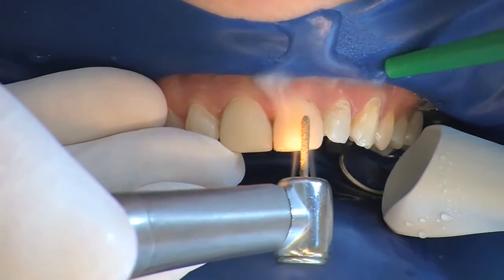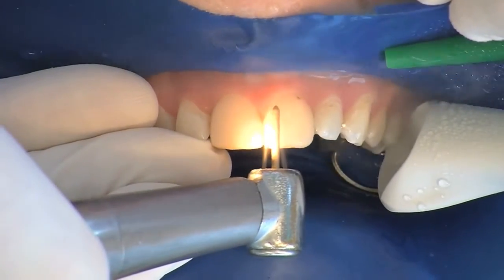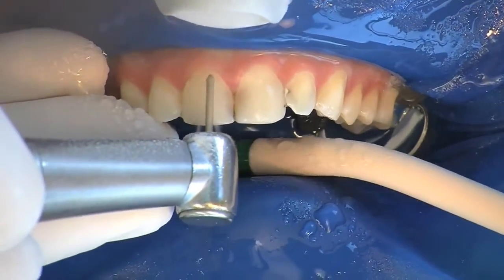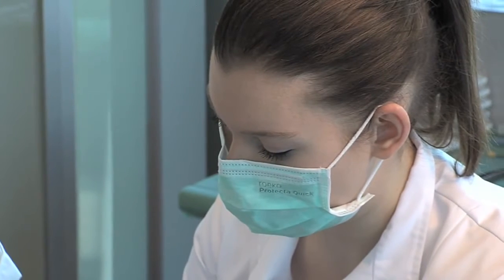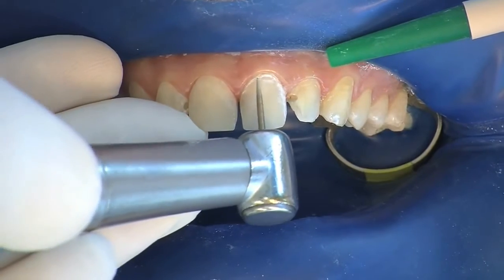This is followed, if necessary, by a reduction of the surface of the teeth, removing as little dental hard tissue as possible. A defined preparation margin as well as shortening of the incisal edges is not necessary. Special attention should be given to cervical parts of the enamel.